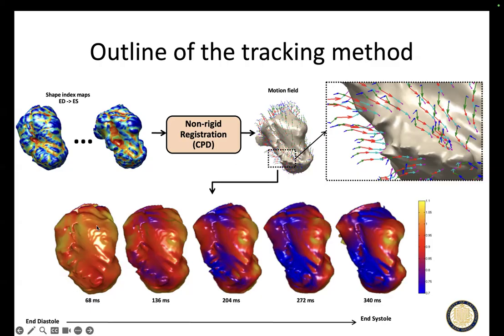So we start at end diastole, and basically we start with a uniformly orange heart, we'll say. As time goes on, the first thing that happens is we get these yellow points, and they're encoded yellow because the surface area increased a little bit. So it's getting inflated a little bit by that atrial kick. And then the ventricle starts to contract at different times across the R to R interval. And what we've encoded is the yellow and orange means we get stretching. And so this part of that heart is actually stretching. It's going the wrong way.